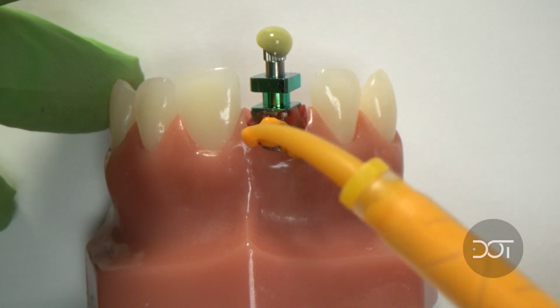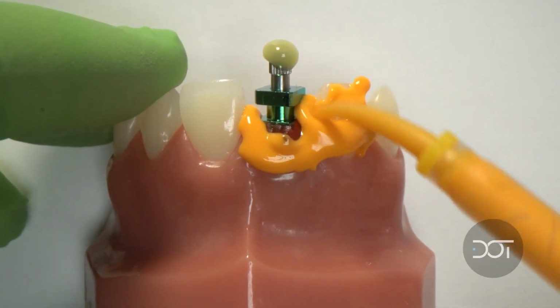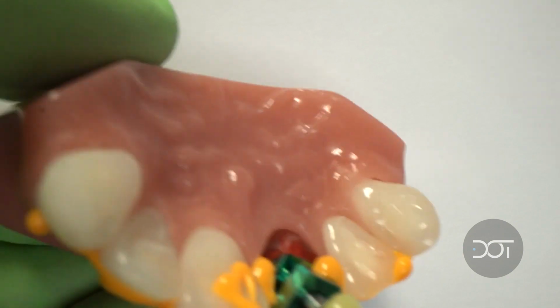And I want to pick up the gingival architecture and also the surface texture of the neighboring anterior teeth. I'll flip over the model, we'll do the same thing on the palatal.